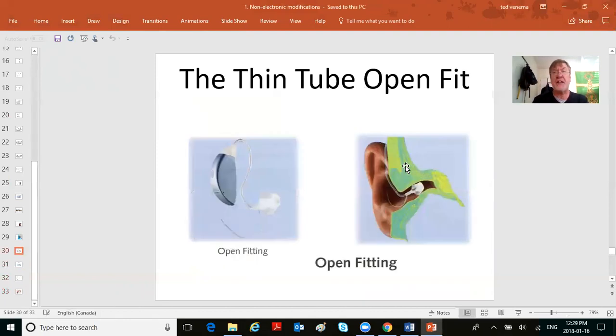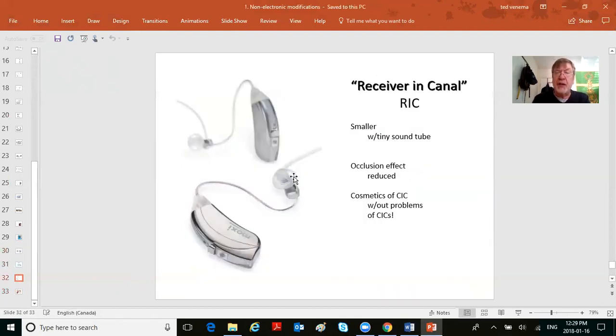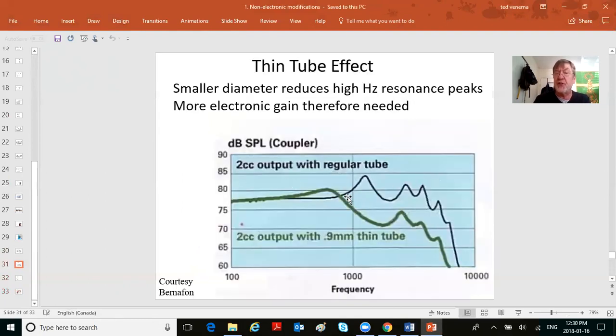They may look identical, but you, the clinician, must know that even though they look the same, all that glitters isn't gold. Open fit is generally cheaper. It's a low-end hearing aid, doesn't cost as much. It's much better if the sound is coming out really closer to the eardrum. You get a much more faithful sound. Plus, you don't get that loss of the high frequencies that you get with really thin tubes. So remember, with thin tube hearing aids, you'd have to boost this and make this match here because you've lost the highs because of the thinness of the tube. Enough on that. Read your handout carefully.